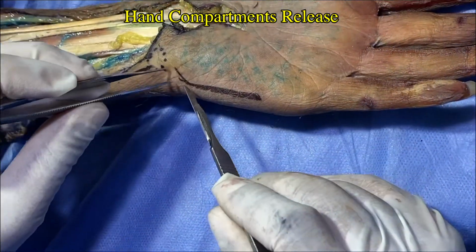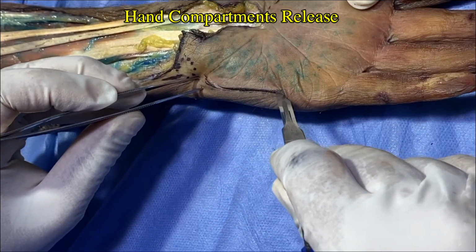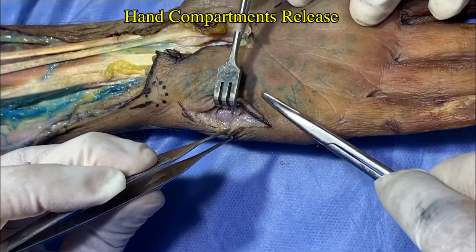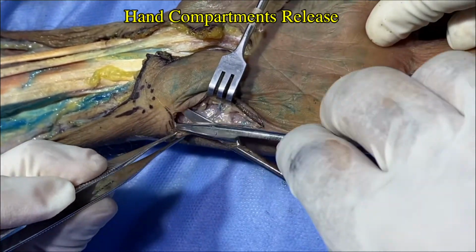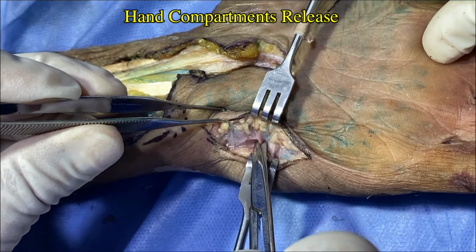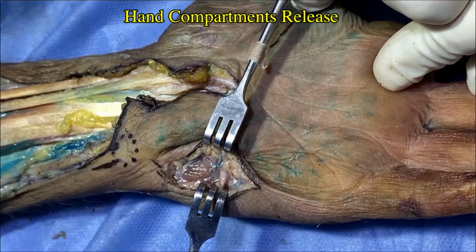To release the hypothenar musculature, we perform a longitudinal incision over the palmar and dorsal interface, immediately below the hypothenar fascia, and we will perform the release, making fasciotomies and fasciectomies, being careful with the ulnar collateral nerve of the fifth finger. Therefore, the release should be performed in the most posterior aspect of the compartment.